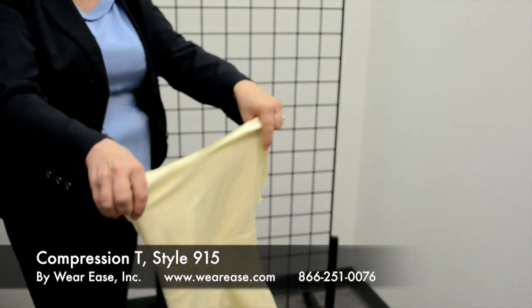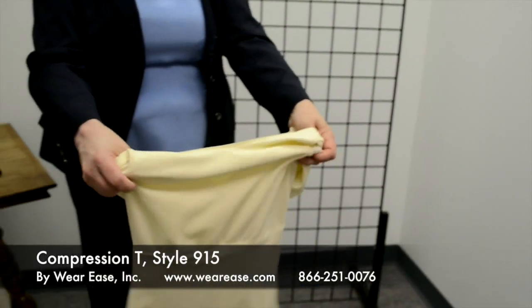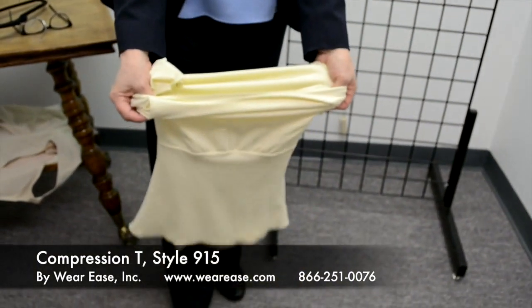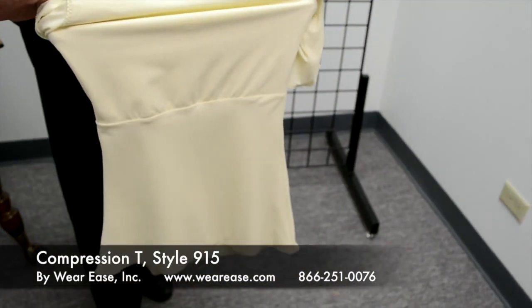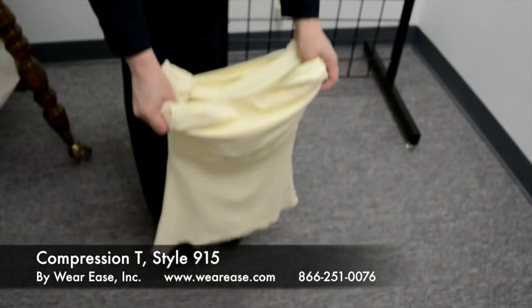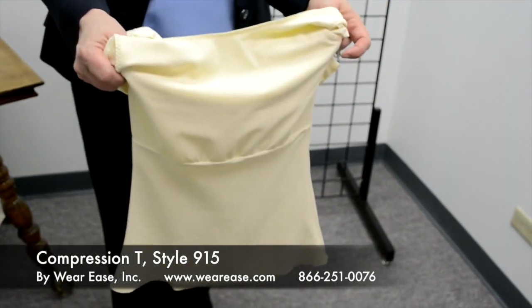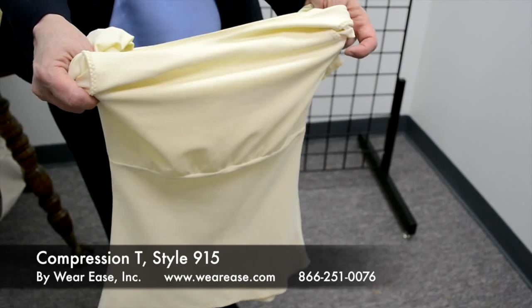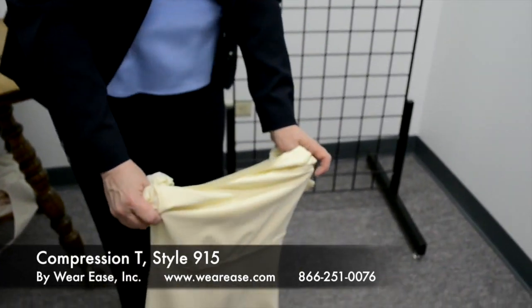This garment can also be worn by stepping into it — gathering and grasping both edges of the garment, stepping into it, and pulling it up. It makes it a lot easier to put on, and you can take it off the same way by sliding it down and stepping out.